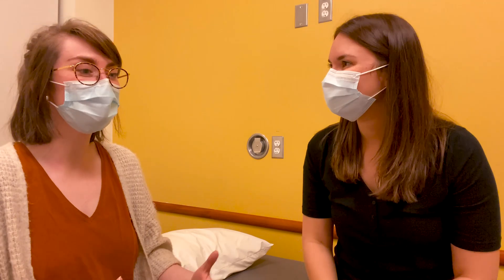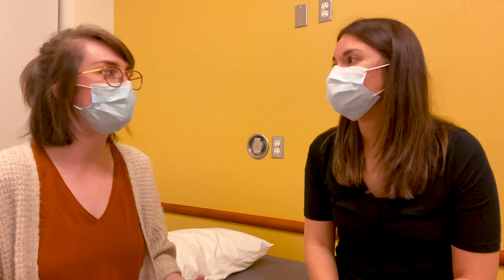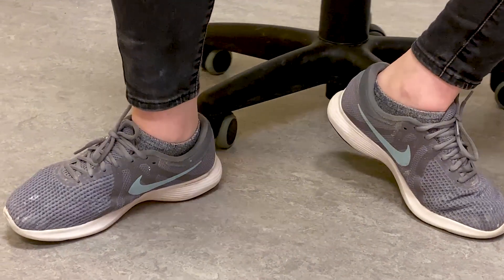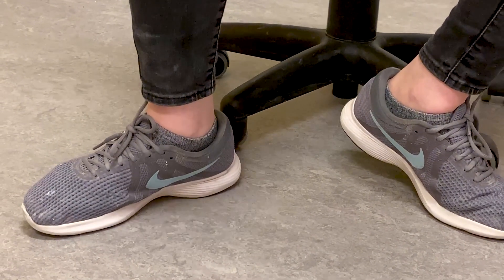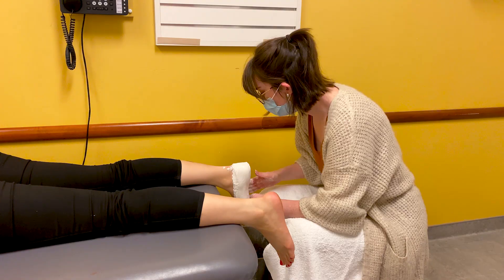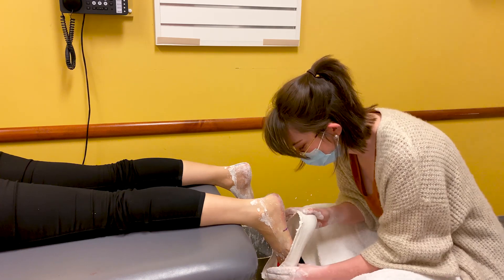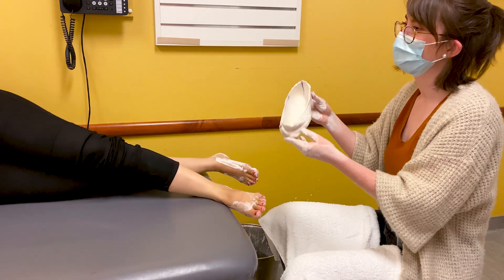Based on all the assessment we did today, you are an overpronator and I think you'd benefit from a pair of custom foot orthotics. Being an overpronator means my foot rolls inwards more than it should, increasing the risk of plantar fasciitis, shin splints, or joint pain if untreated. So I'm going to get casted for orthotics to prevent those things. Wendy does this while I'm lying down because it keeps my feet in a neutral position, allowing her to create an orthotic that best supports my arches. We'll head to finance and see you in about two weeks — and bring shoes big enough to accommodate the orthotics, at least a half size bigger than normal.